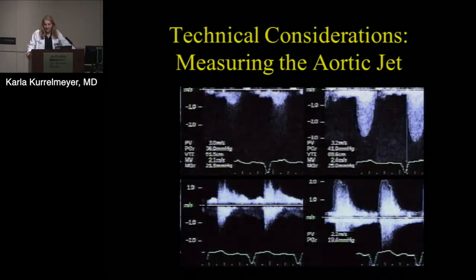Well, this is where you have to use the 2D picture. If the 2D picture looked like it was a very calcified valve with restricted movement, you need to use the blind PEDOF probe regardless of what that guided probe told you, because you probably are not aligned, because you can see with your own eyes that picture that's showing you that it's a very stenotic jet. And that's really what happened in this case.